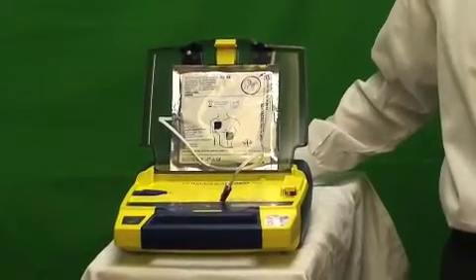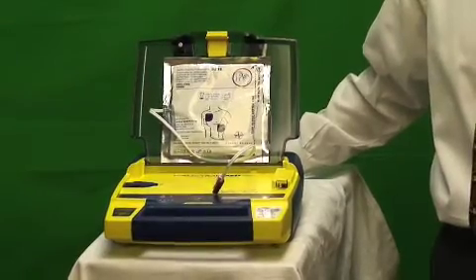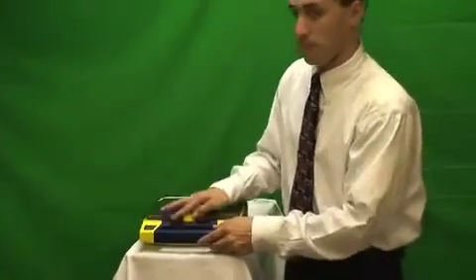Service required. Stay calm. Follow these voice instructions. Make sure 911 is called now. Make sure pad connector is plugged into AED. In this scenario, the pads were unconnected and the unit was alerting us to come check and reconnect the pads.